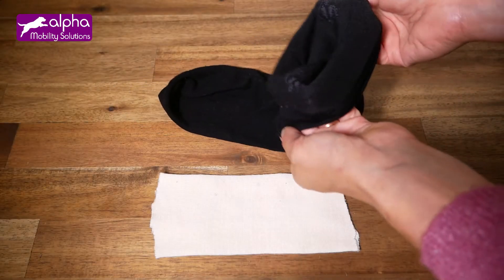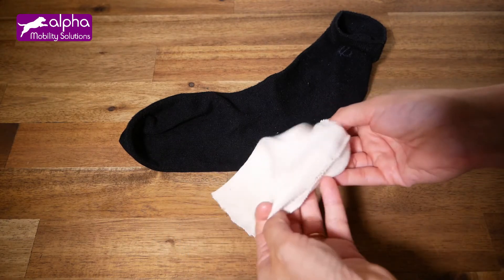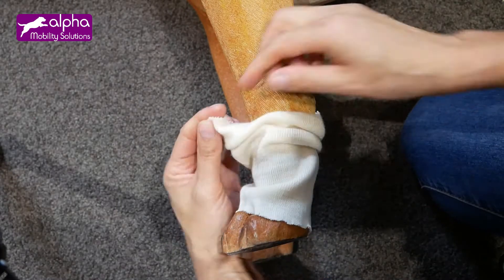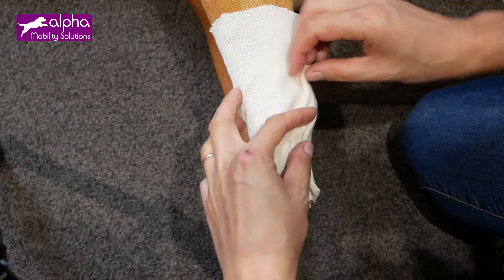Select a form of soft protection such as a sock. It will be placed between the sheet and the patient's skin. Place the sock around the wrist. Be careful to leave no folds in the area where you wish to mold the splint.